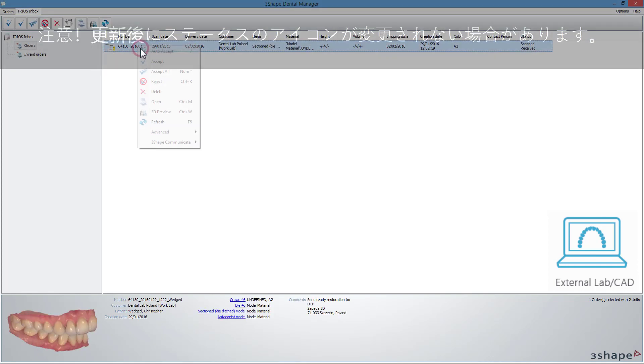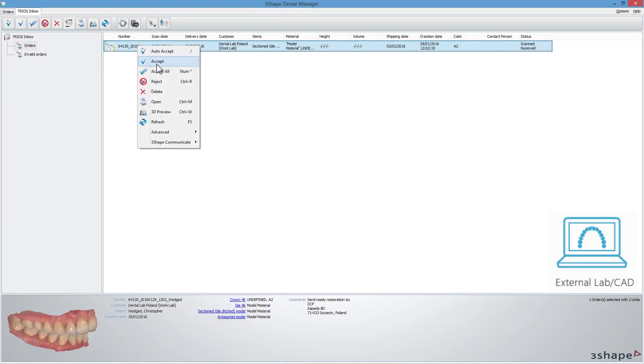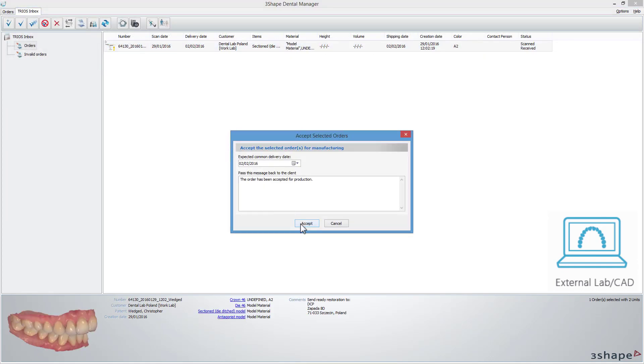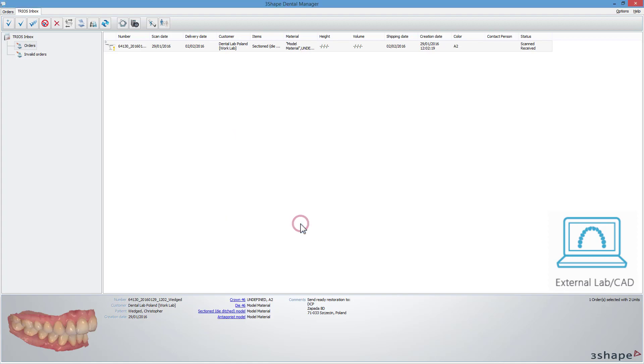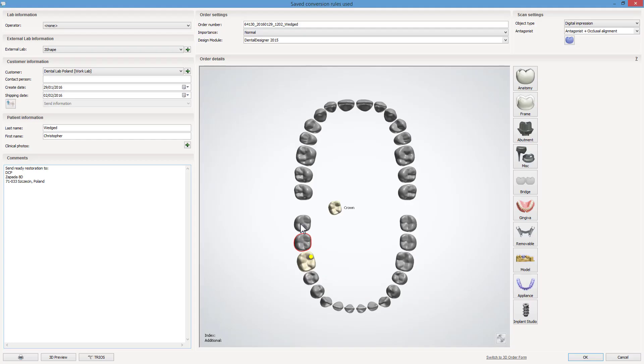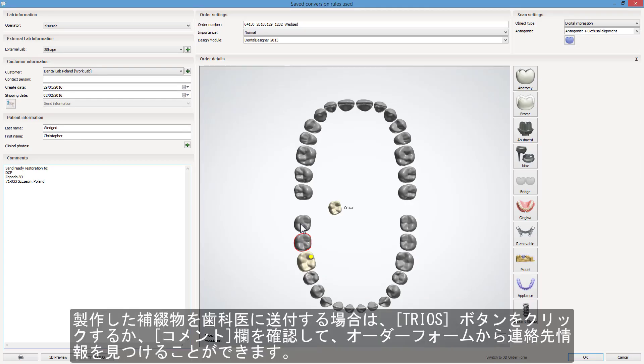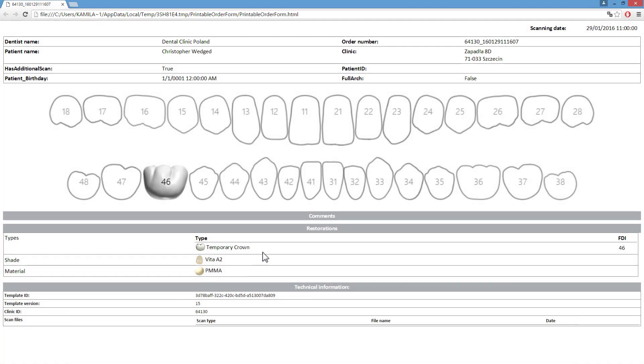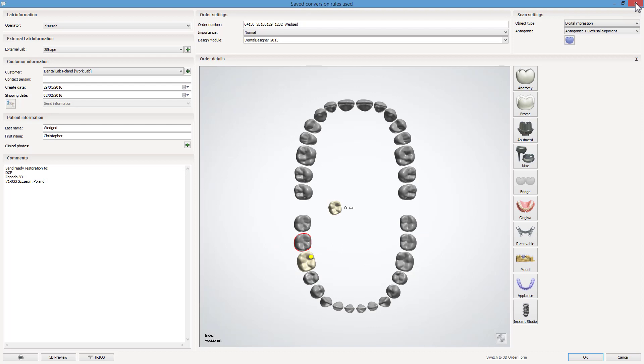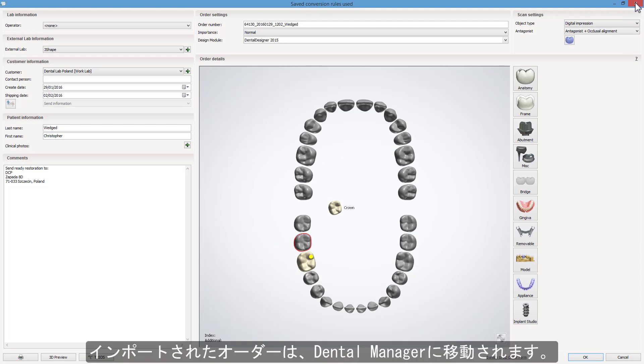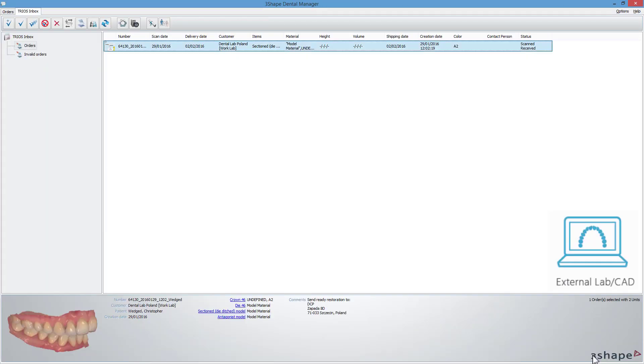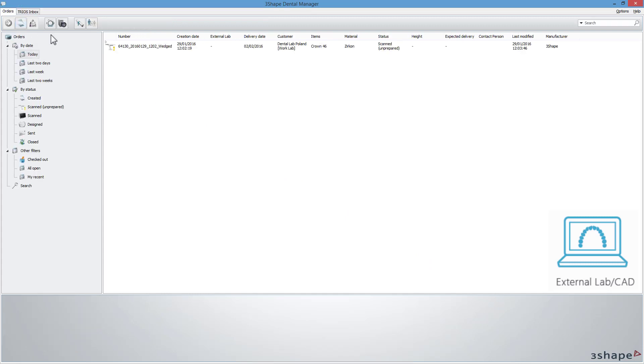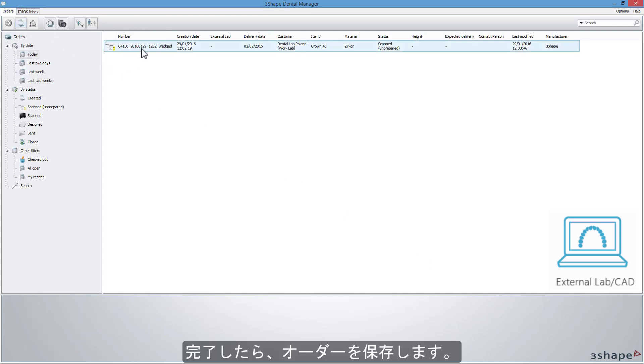Accept it. If you are going to send a produced restoration to the dentist, you can find contact information through the order form by clicking the TRIOS button or check the Comments field. The imported order will now move to the Dental Manager. Proceed with the design as you usually do. After finishing, save the case.